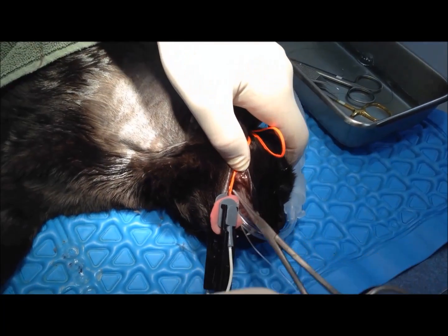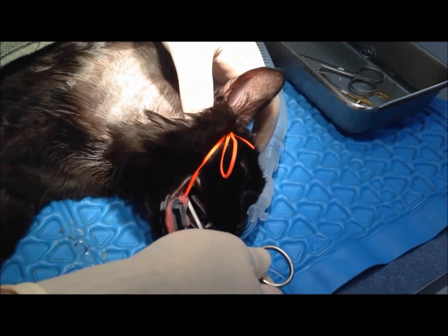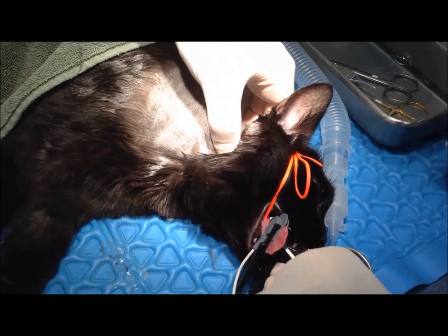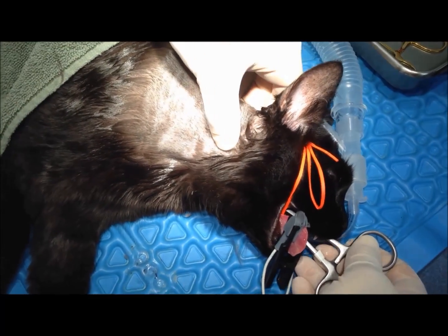I don't have any teeth. She did. Our landmarks are we're going to be palpating for the wing of the atlas, which is right there.